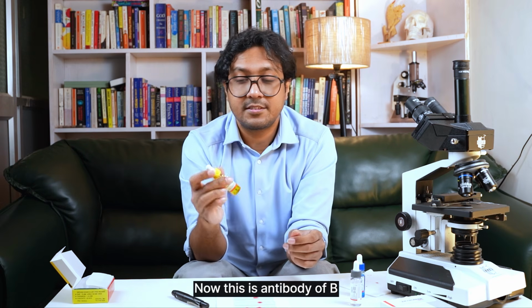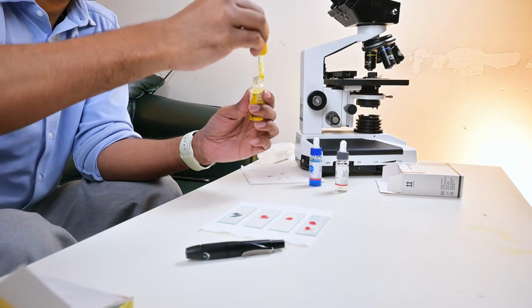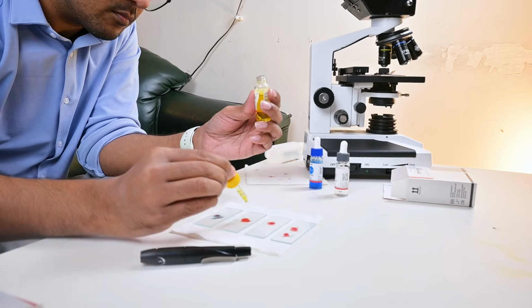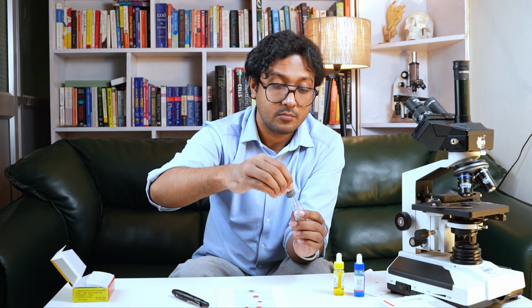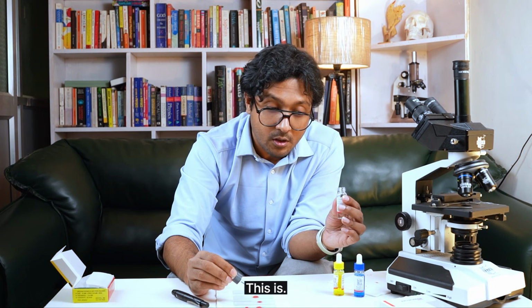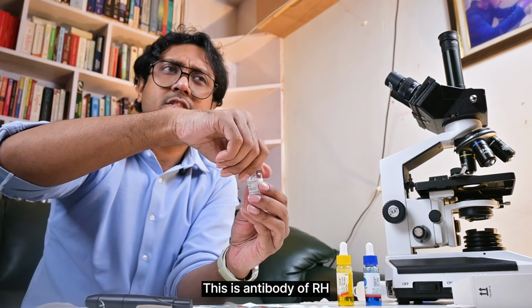Now this is antibody of B. This is anti-Rh, the antibody of Rh.